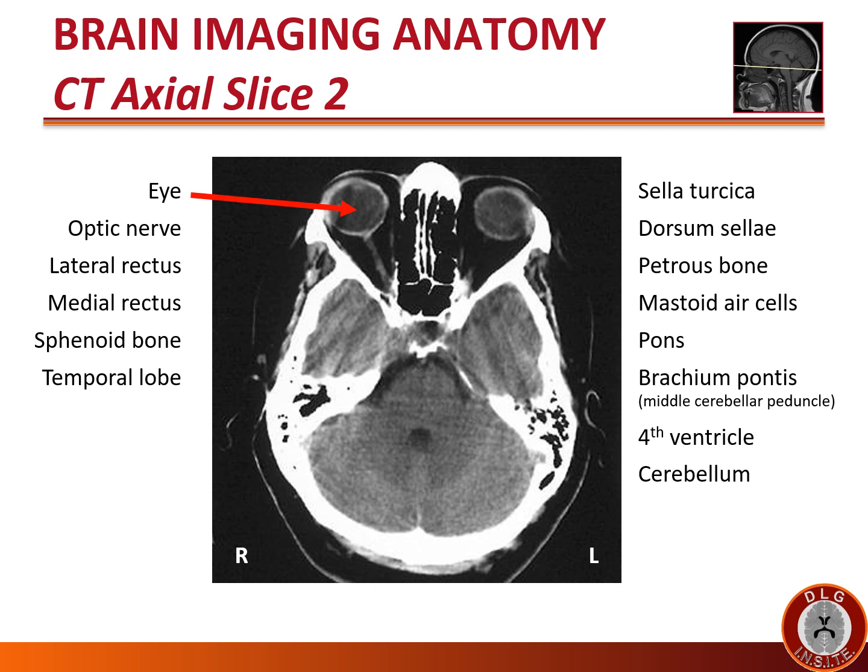The eyes are once again easy to identify. Note the image is slightly asymmetric — the lens is still partially seen in the right eye and not seen at all in the left eye, as we are above the level of the lens on that side. The optic nerve is the structure entering the eye posteriorly. Note that we only see the right optic nerve, not the left, because of the asymmetric way the slices were obtained.